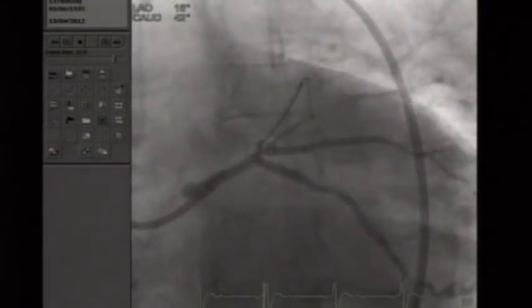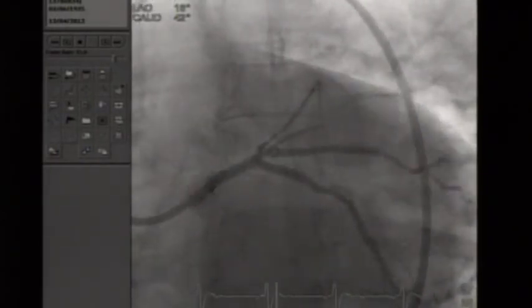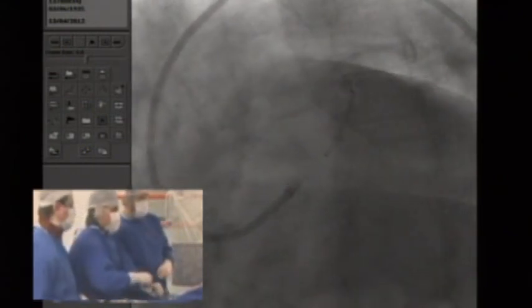What kind of generation is the OCT used? This is the C7. The second, Alex, what do you think about the position of this stent? Because is it possible to take the information when the second generation is not available in the lab? You may miss some of the ostiums with IVUS. That's better. Yeah, but now we have C7, which is much easier, no balloon occlusion, and faster in terms of.